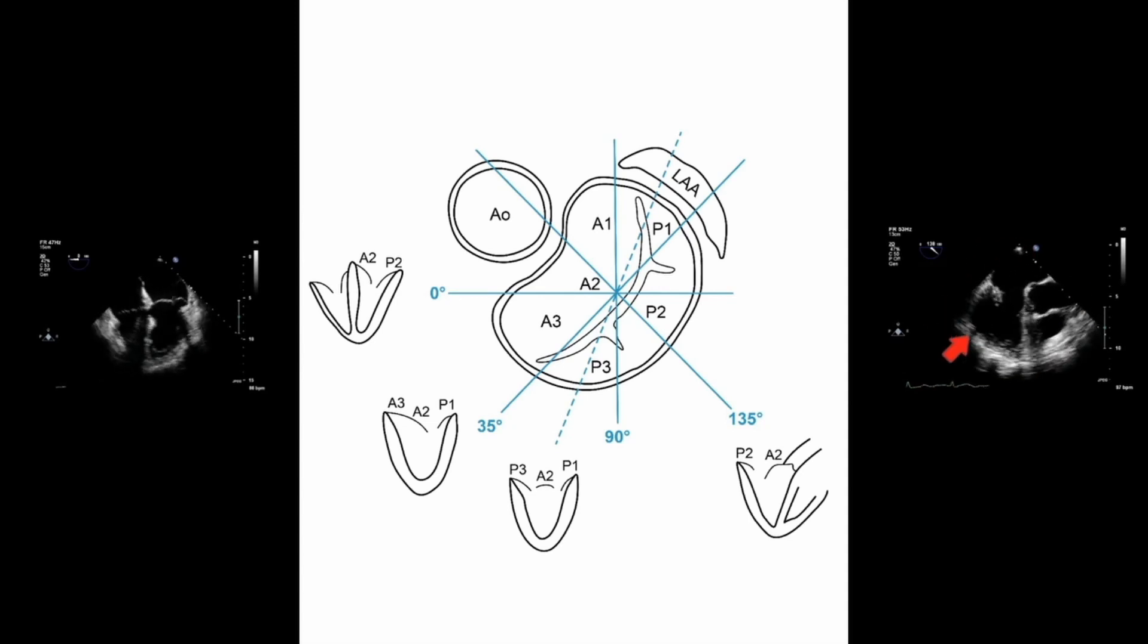On the right hand side of the screen we have a different view of the mitral valve. This is the long axis view of the heart. This is obtained at an imaging plane angle of 135 degrees and as you can see from the diagram, this also cuts through the A2 and P2 mitral valve segments.